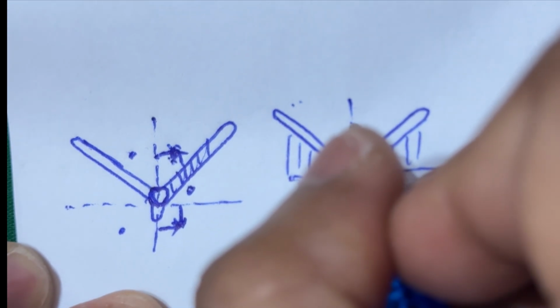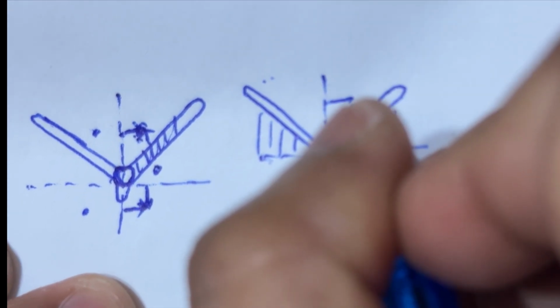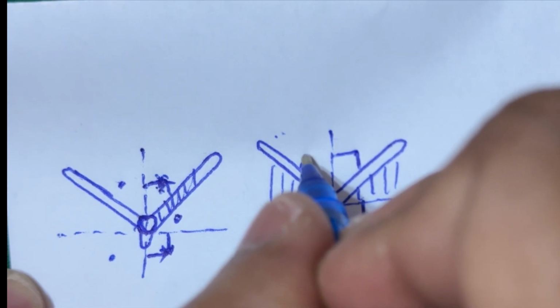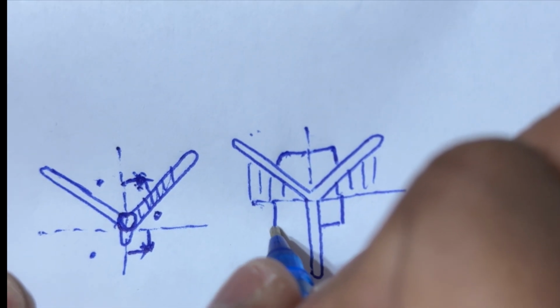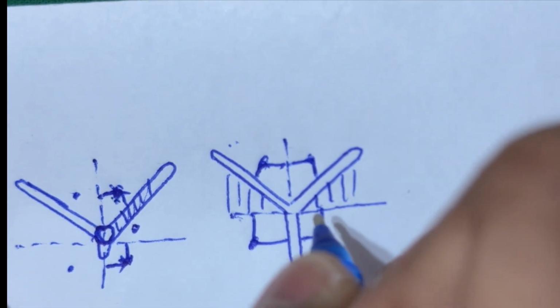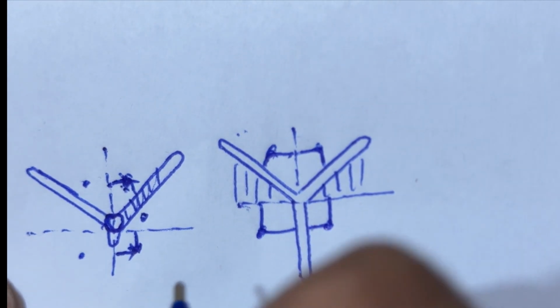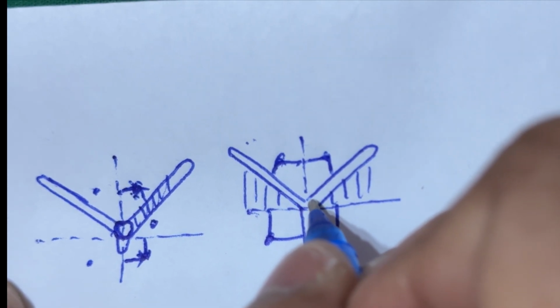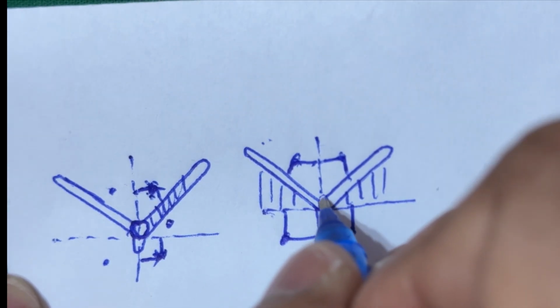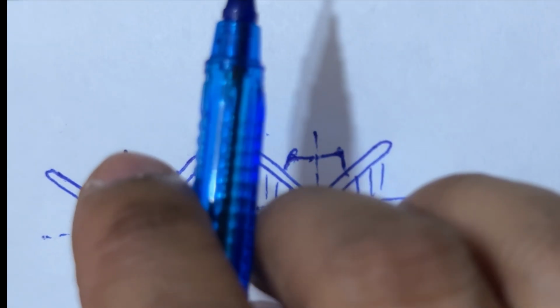On this part, an x distance from this imaginary line and an x distance from this edge, sorry, understood? Similarly here also we will do the same thing. So these are the points, look here. If you do it this way, the benefit is that even the angles will be closed properly, or else only these areas will be closed but the angles will not be closed. So let me demonstrate and show you.